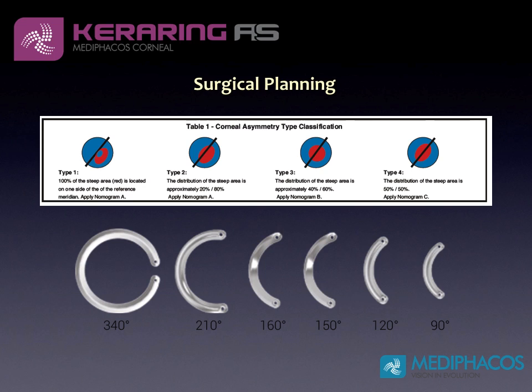Each type of keratoconus has its own dedicated nomogram. Basically, the more asymmetric the distribution of the ectatic area, the more asymmetric the implantation shall be. And today we can have a variety of arc lengths and thicknesses in order to address each individual case.